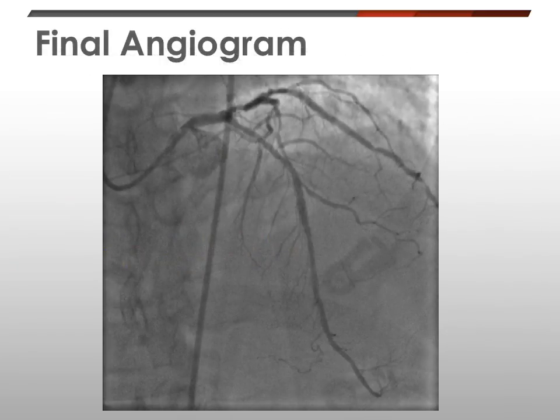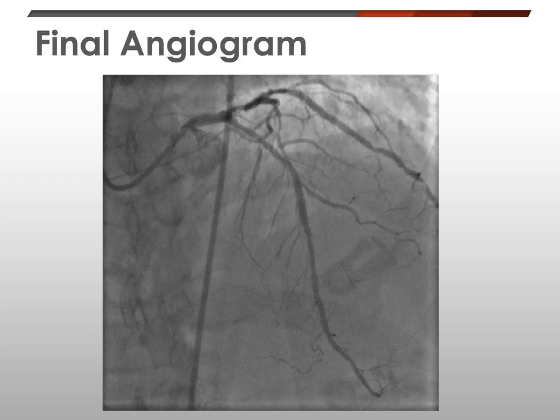The final angiogram after giving intracoronary adenosine shows that the stent is well deployed in the LAD and the diagonal branch is well preserved. There is some diffuse disease in the distal LAD, but the final FFR in the distal LAD was non-ischemic at 0.89.